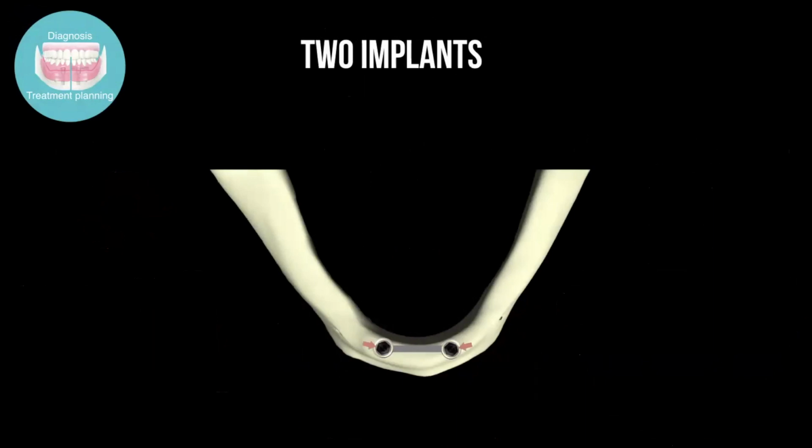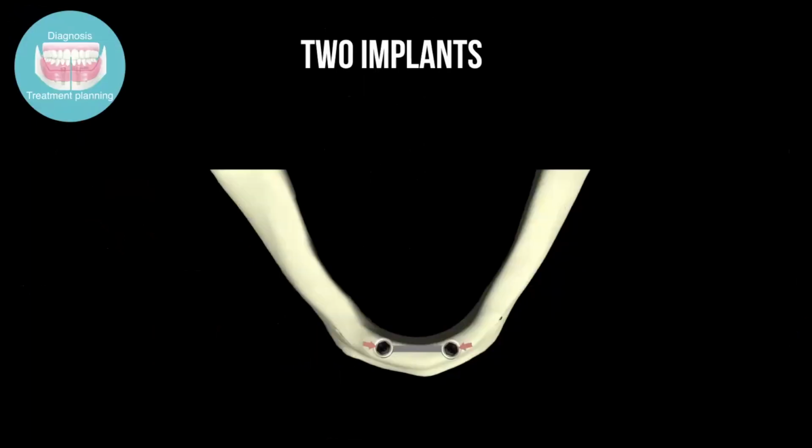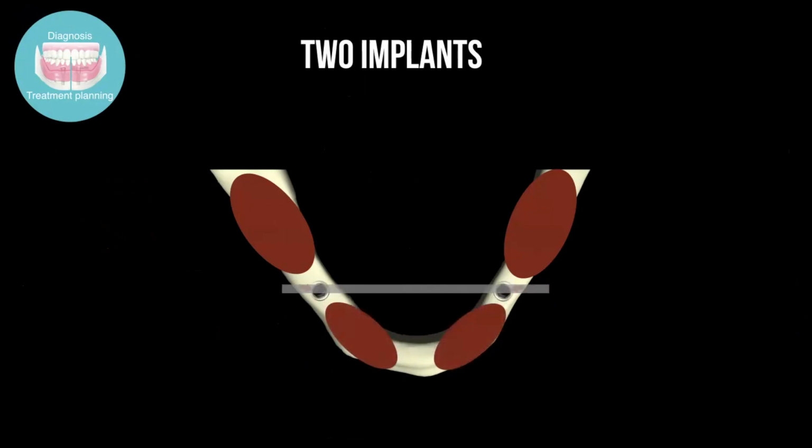Why we keep talking about canine or lateral positions is because when you place the implants too far back, in the second premolars or molars, then you have a fulcrum line going all the way to the middle of the ridge, that line that crosses those. In that case, you have 2 sides that the denture can move around, and you're not actually doing a great service. So in these cases, it's better to add 2 more implants, or at least 1 more implant, to have a tripod to make the denture more stable.